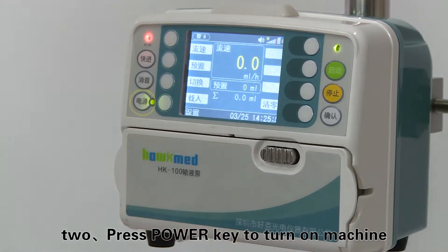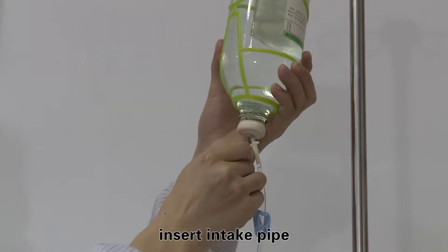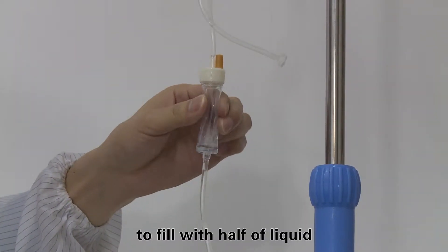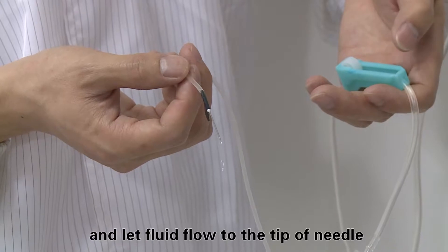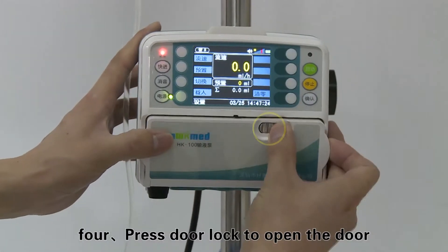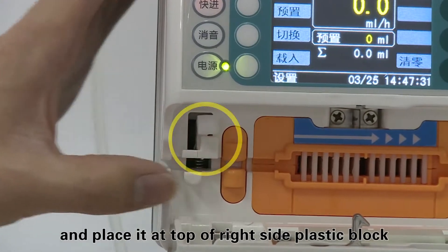Step three: close the flow clip, connect the IV set to the fluid bottle, and insert the intake pipe. Squeeze the drip chamber to fill it halfway with liquid. Open the flow clip and let the fluid flow to the tip of the needle, then close the flow clip again. Step four: press the door lock to open the door, upward the anti-free flow clamp, and place it at the top of the right side plastic block.